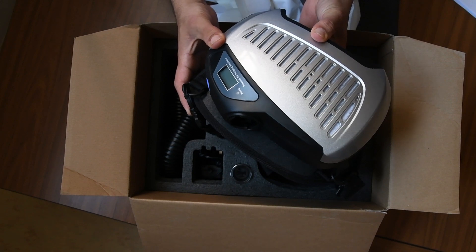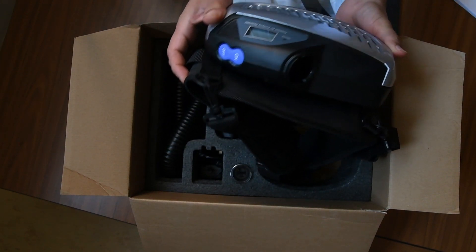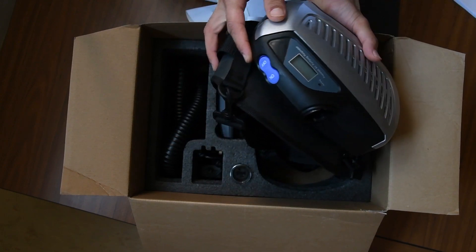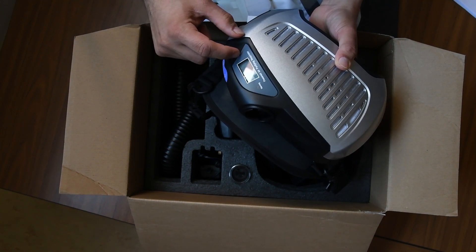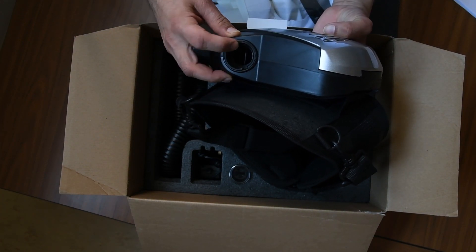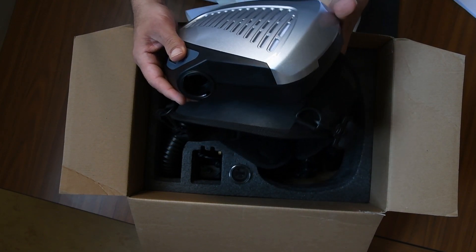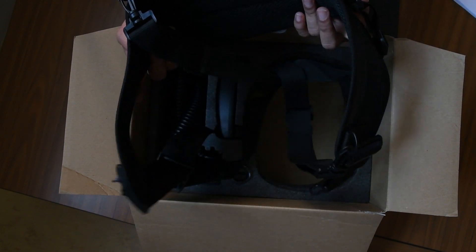This is the respirator, which is the main part of the equipment. As you can see, it has a very simple on/off button switch. There is a display and also a warning sign, as well as the attachment for the flexible tube. That's your HEPA filter, and there is a shoulder harness.